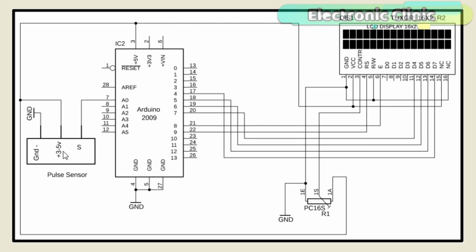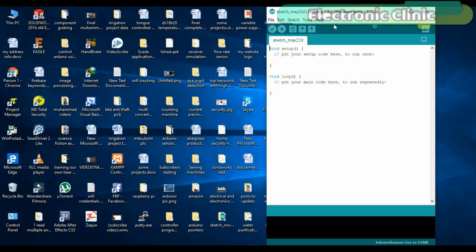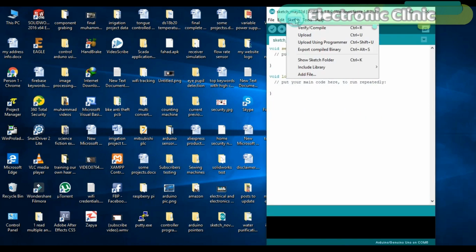The VCC pin of the pulse sensor is connected with the 5 volts, but you can also connect this with 3.3 volts. The S pin of the pulse sensor is connected with the analog pin A0, and the ground pin of the pulse sensor is connected with the Arduino's ground. Now let's discuss the programming. Before you start the programming, first of all, make sure that you download a library for the pulse sensor.